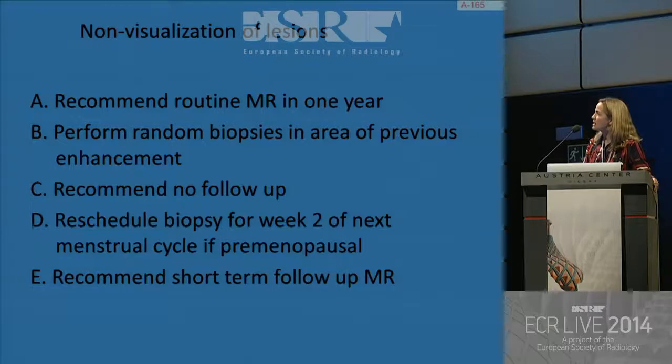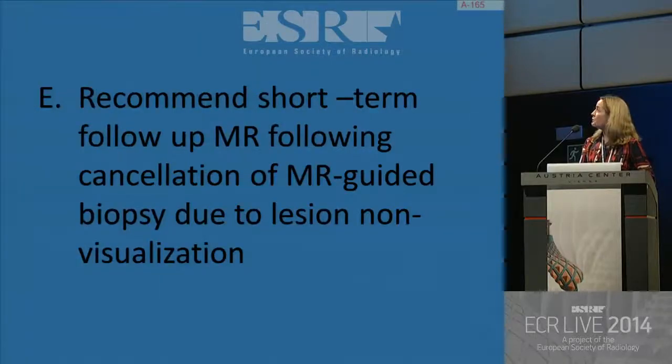Do we C, recommend no follow-up? Do we D, reschedule the biopsy for week 2 of the next menstrual cycle if she's premenopausal? Or do we E, recommend a short-term follow-up MR? Well, that was the answer, that we recommend a short-term follow-up MR.